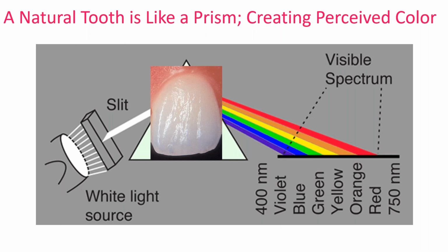We don't want to have a room that has access to a window, because throughout the day, as it gets cloudy or it's sunny, the angle of the light, the sun, it's going to be different throughout the day. So you're going to get different shades. Even if you had the patient come in the morning, and then in the afternoon, you would visually see different shades.